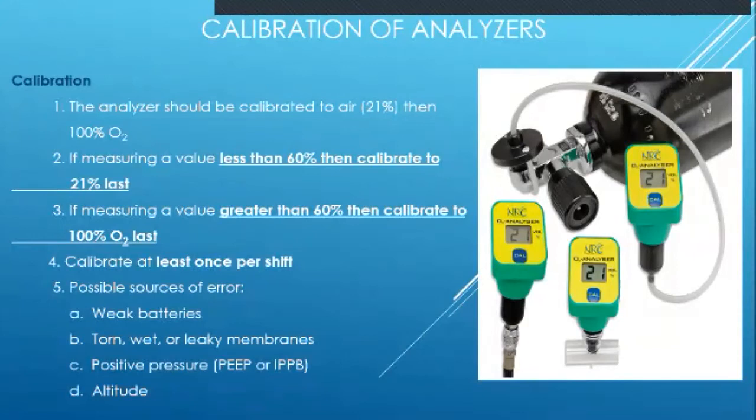Now, when I first pull an oxygen analyzer out of the box, the first thing I have to do is calibrate it to room air and then calibrate it to oxygen, which is 100%.